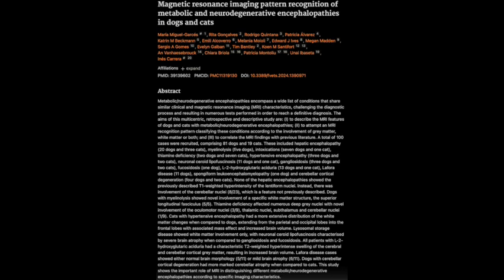So you look at it and you're like, this is the fingerprint of hepatic encephalopathy, or this is the fingerprint of gangliosidosis. Now, you mentioned that they included 15 different diagnoses. Yes. That's a lot. Can you give us a little rundown of what those were? Sure. So on the metabolic side, they included hepatic encephalopathy, liver failure. They included several intoxications. Okay, so like poisonings. Got it.